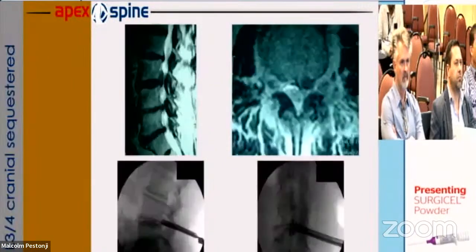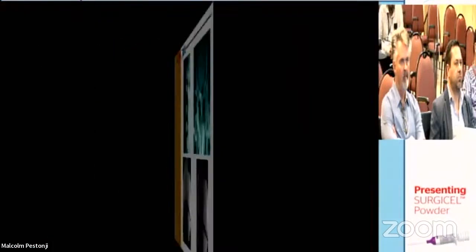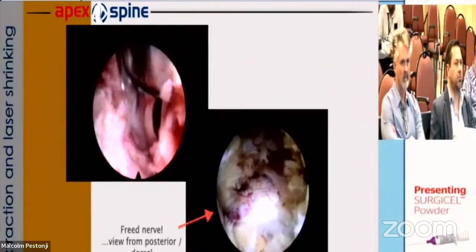So I did perform also the transforaminal approach. It is very easy. I did not have to go transiliacal. Here you see a cranial sequestrated disc herniation at level L3-4, and here a dorsal cyst at level L5-S1, and also here the control of the forceps, perfect.